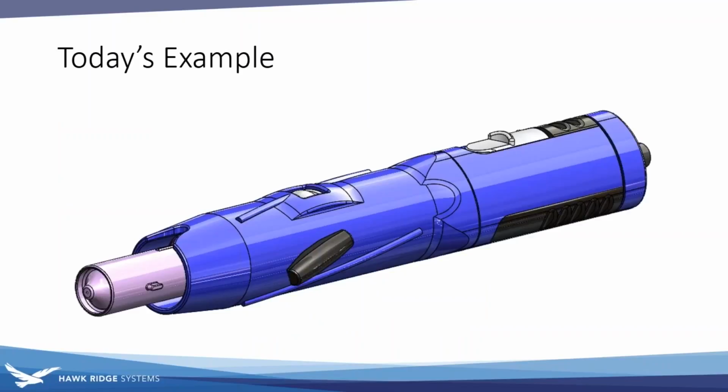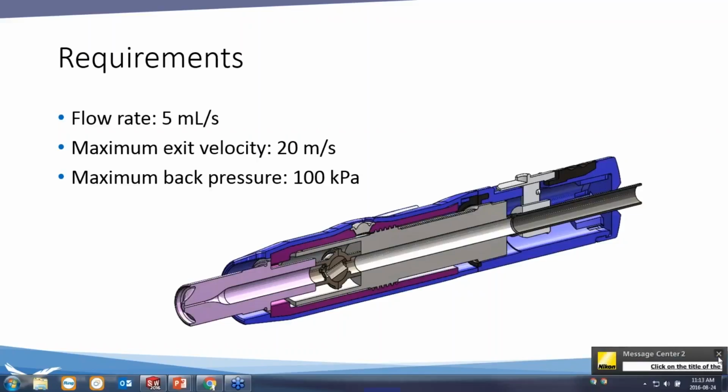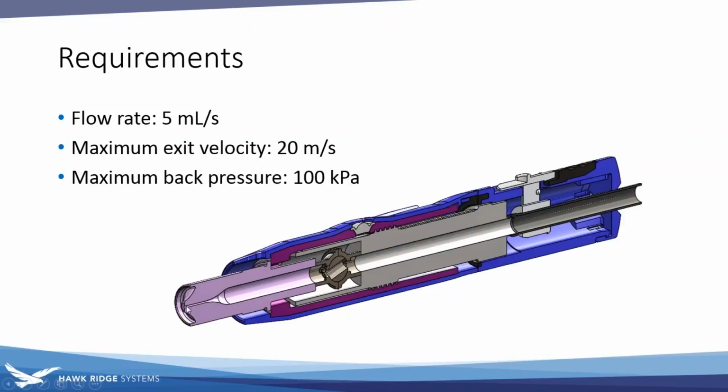Let's talk about what we're going to go through today. Today's example is going to be this device here. It's going to be a catheter for applying a dosage, and we're going to have some requirements that we're going to design it for. And so we've got our flow coming in from the tube on the backside. It passes through the device. Mostly it's just a straight shot through. And we're looking to have a flow rate of 5 milliliters per second, but we do have some hard constraints. We're concerned about the exit velocity of this device, and we're concerned about the amount of back pressure that's going to be generated, specifically as it fires through this small nozzle at the front here.